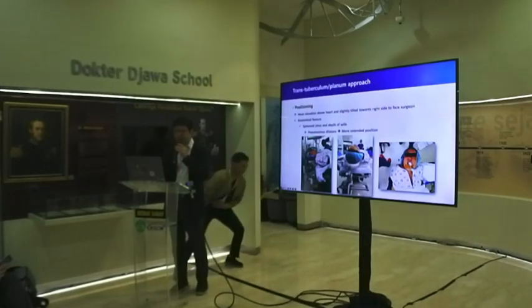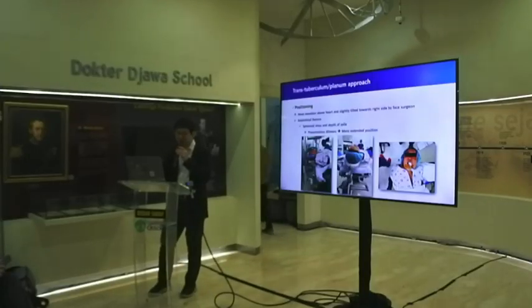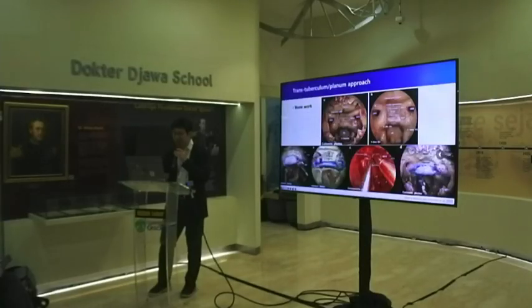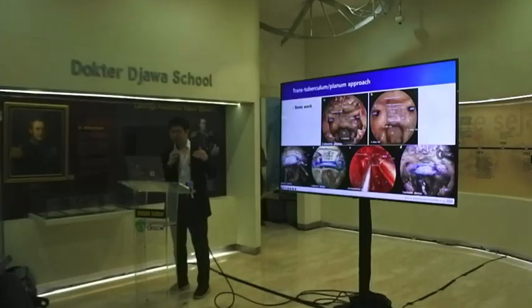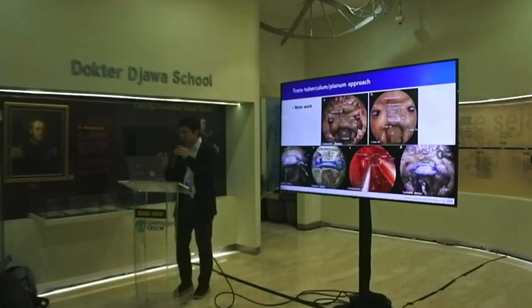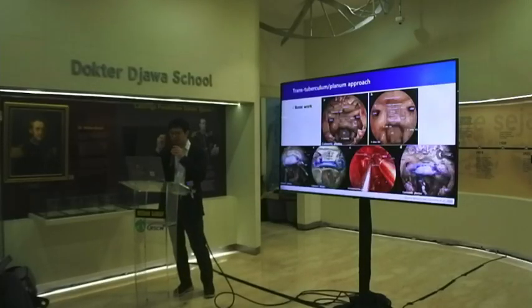So, pneumosinus dilatans can be identified in the preoperative CT. After bilateral anterior and posterior ethmoidectomy and wide bilateral sphenoidotomies, the visualization of the sellar protuberance defines the center of the skull base. And next, the intrasphenoid sinus septa are trimmed, facilitating the identification of the transsphenoid sinus anatomy and bony protuberances.